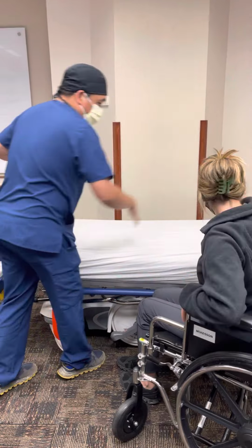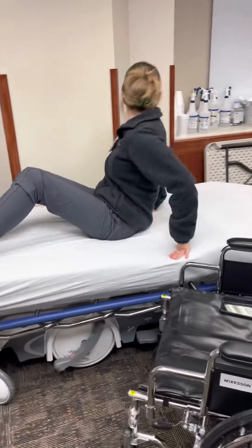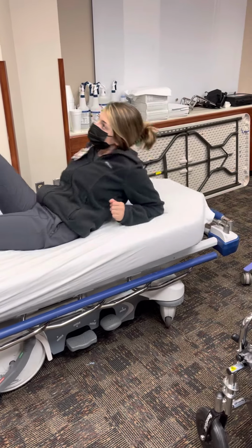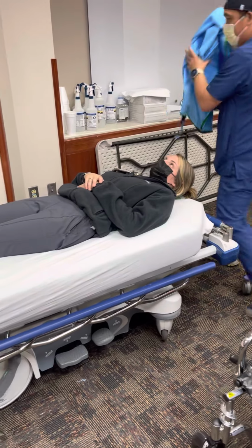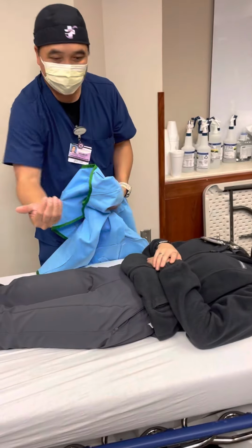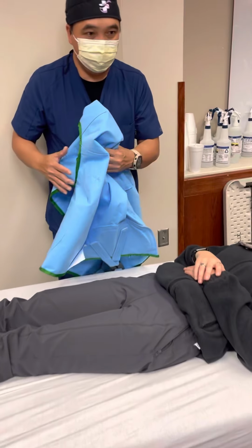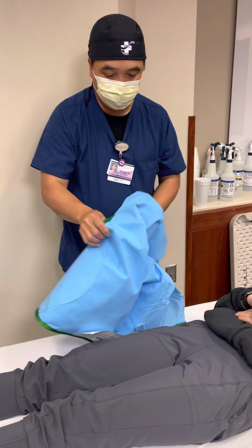Paige, can you lay down right there all the way with the head as close as you can to the edge? Can you go a little bit higher here? Thank you. Now this bed that we have right here is a stretcher, so there's a frame on the bottom. Unfortunately, I cannot get it all the way in the lift, so we have to modify a little bit, but it should be the same idea when you use it on the real bed up on the floor.